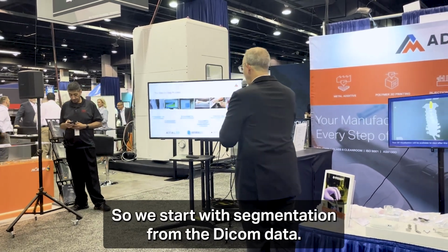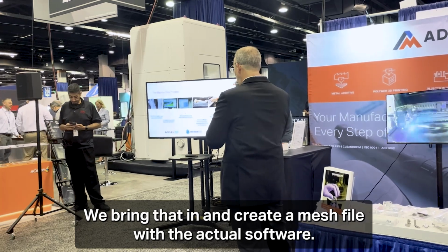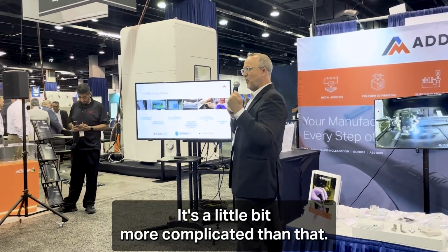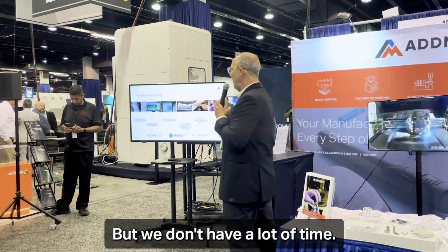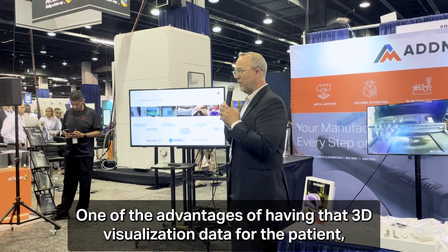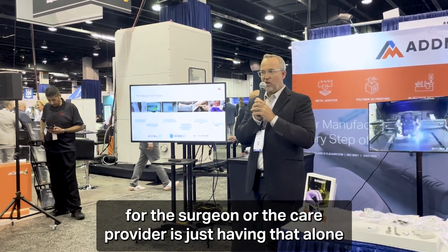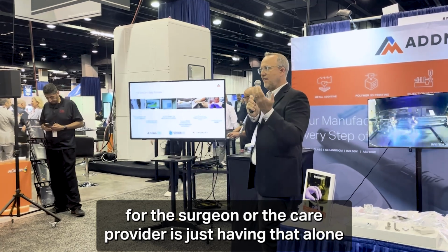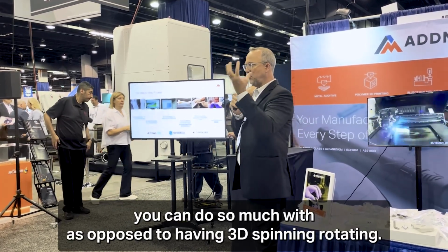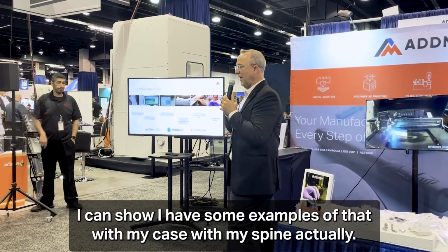So we start with segmentation from the DICOM data. We bring that in and create a mesh file with the Axial software. I'm simplifying it; it's a little bit more complicated than that, but we don't have a lot of time. From there, we get a 3D print-ready file. One of the advantages of having that 3D visualization data for the patient, for the surgeon, or the care provider is that just having that alone you can do so much with, as opposed to not having that in 3D, spinning, rotating. I have some examples of that with my case, with my spine actually.